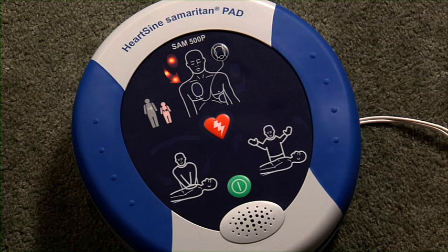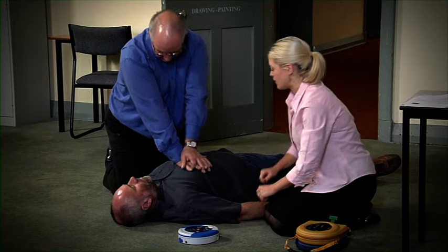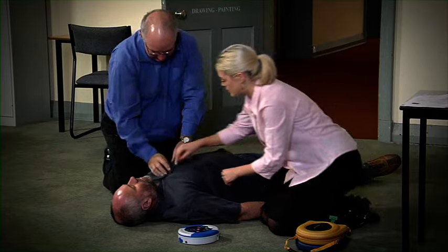Adult patient, call for medical assistance. Remove clothing from the patient's chest to expose bare skin.